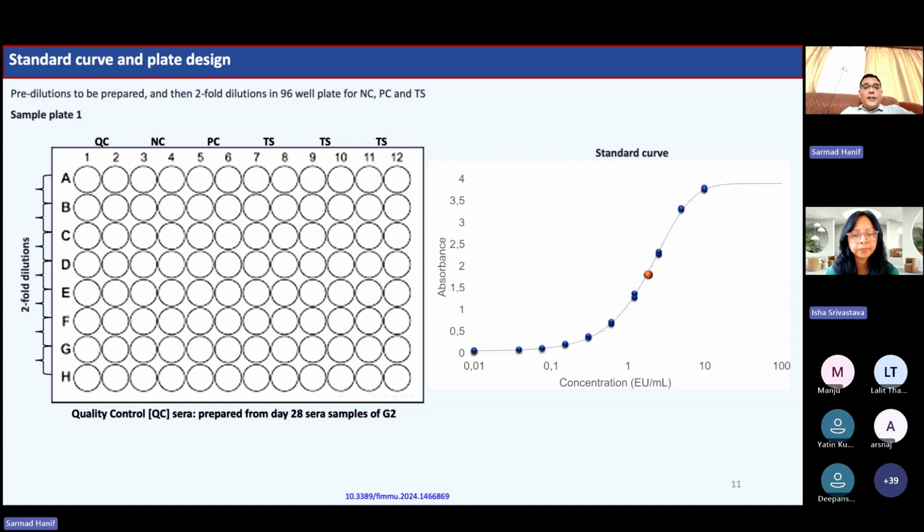Yes, this quality control will be difficult for newer diseases if they come, because there is no reference available with the WHO or, for example, NIH or CDC. So it will be a difficulty. Understood. Thank you so much. You will have additional steps for the establishment and the optimization of the ELISAs. Yes. Okay. Understood.